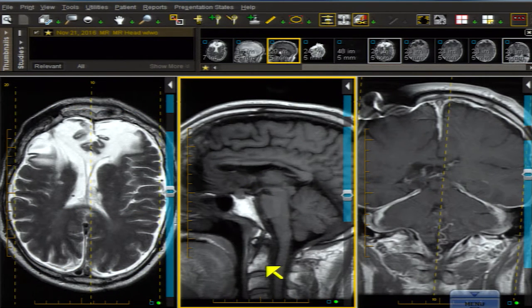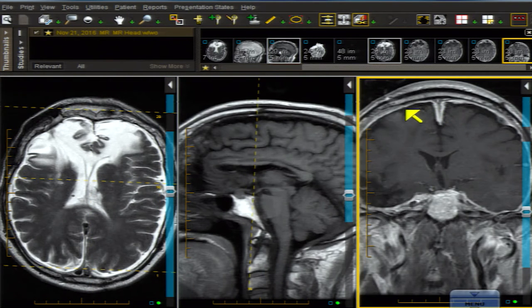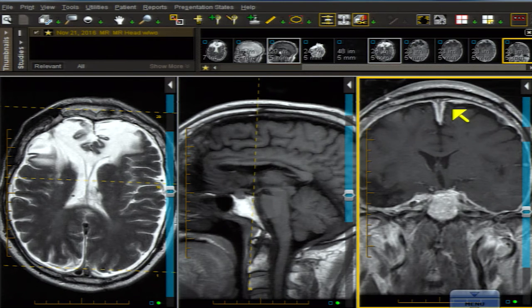I am thinking that this is a shunted patient, and the question is: how is this shunt working? Shunts, as you know, can stop working or they can work too well — which is the problem here. The ventricles aren't big here, they're small. Also look at the pachymeningeal enhancement, like you'd see with tumor or something. So that's one finding: ventricles small.